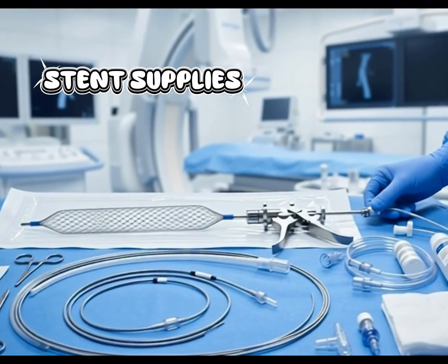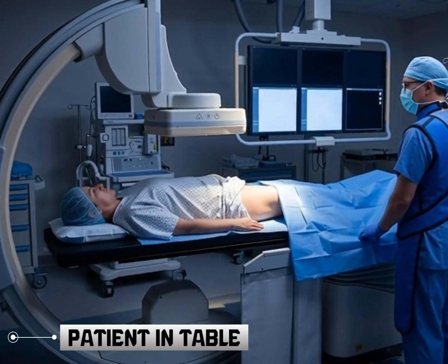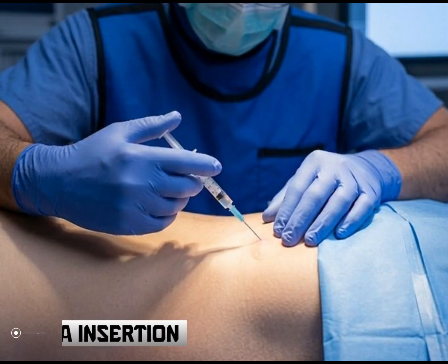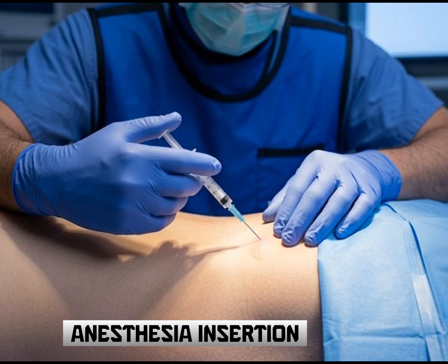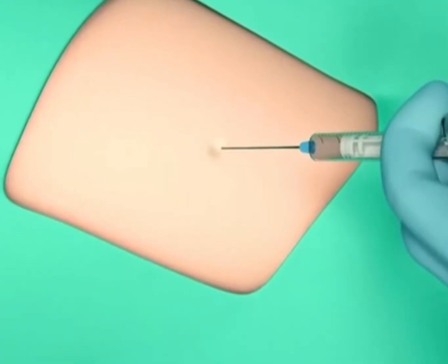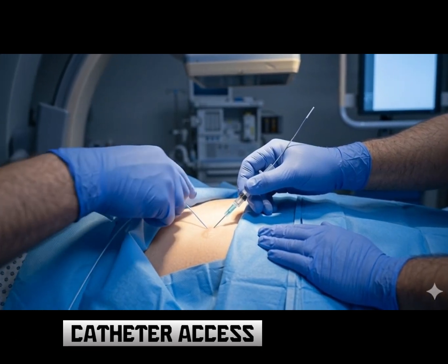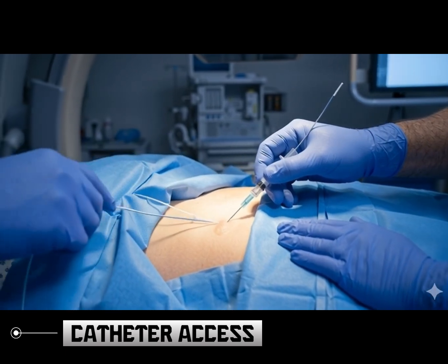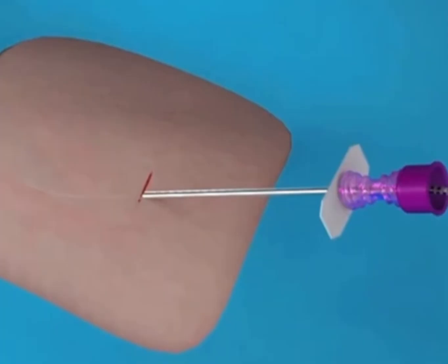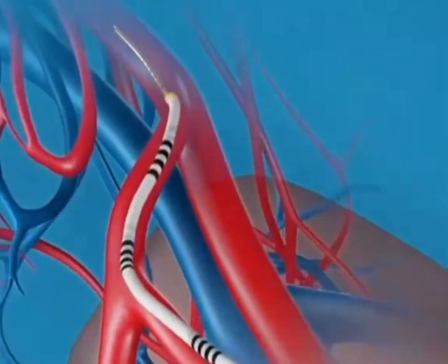And the supplies first are the stent supplies and angiography supplies. First is the patient on the table. Second, the insertion site, usually the wrist or the groin, is cleaned and numbed using local anesthesia. Third, the catheter is inserted into the blood vessels and guided carefully toward the heart using fluoroscopy, as you can see in the video.